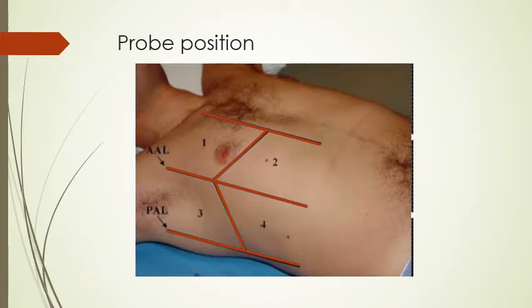Another sequential approach to lung ultrasound is the use of the Volpicelli zones. There are 4 Volpicelli zones, and these can be identified and delineated by drawing imaginary lines in a rostrocaudal fashion along the sternum, then the anterior axillary line and posterior axillary line, and having an imaginary line drawn around the 5th intercostal space along those lines.